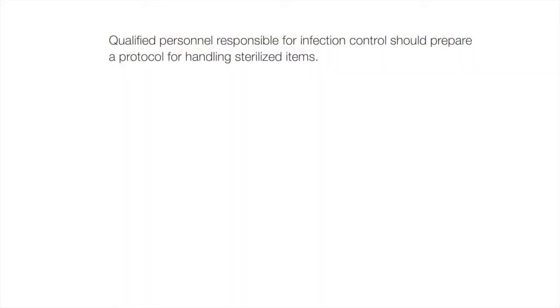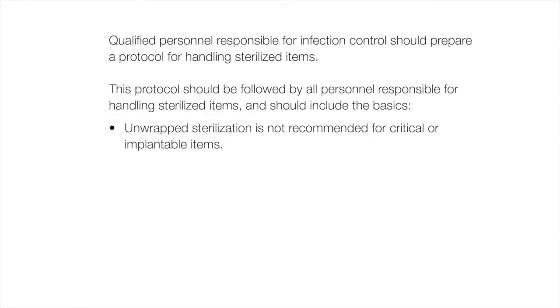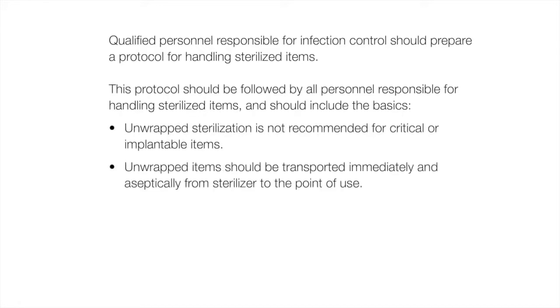Qualified personnel responsible for infection control should prepare a protocol for handling sterilized items. This protocol should be followed by all personnel responsible for handling sterilized items and should include the basics. Unwrapped sterilization is not recommended for critical or implantable items. Unwrapped items should be transported immediately and aseptically from sterilizer to the point of use.